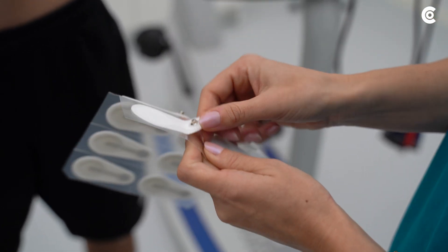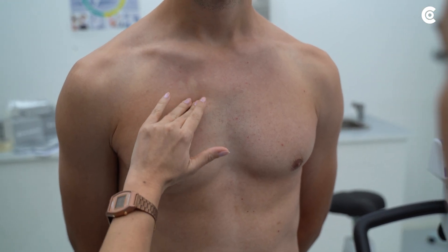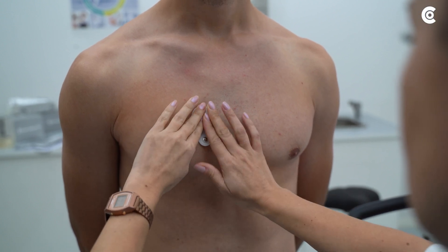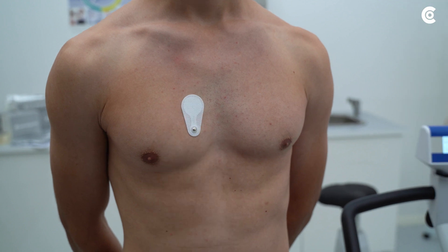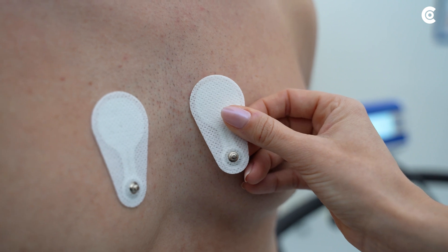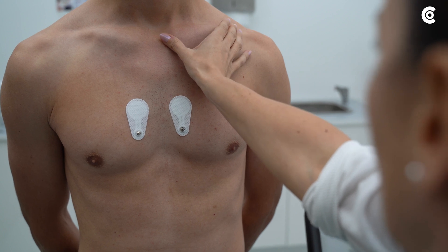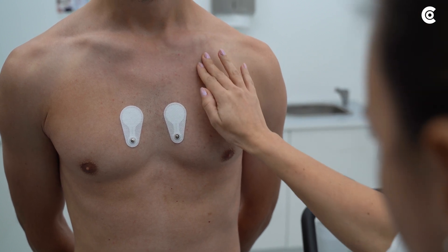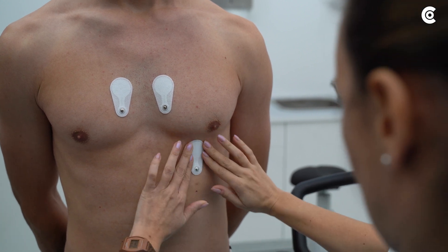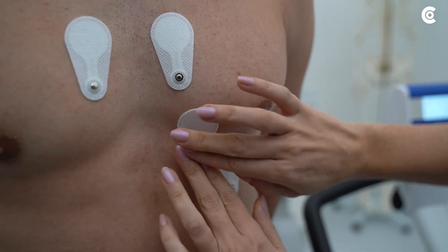In the next step, place the electrodes according to Wilson. The electrodes C1 to C6 are placed on the chest wall as follows: C1 in the 4th intercostal space at the right sternal border. C2 in the 4th intercostal space at the left sternal border. C4 in the 5th intercostal space on the left mid-clavicular line. C3 left on the 5th rib between C2 and C4.